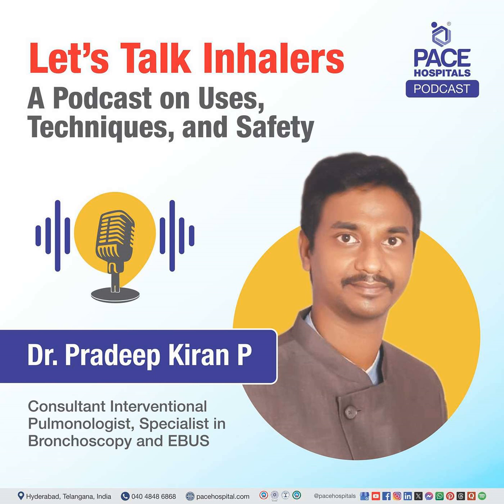And which age group can use what? It doesn't necessarily matter. A person who can hold his breath is much more suited to these MDIs. Old age persons or mid age persons who cannot hold their breath, in those cases dry powder inhalers along with these Accuhalers will be important. So with any type of inhaler, the same drugs will be there. Correct protocol or sequence of events will give you better drug delivery and better control of your symptoms.